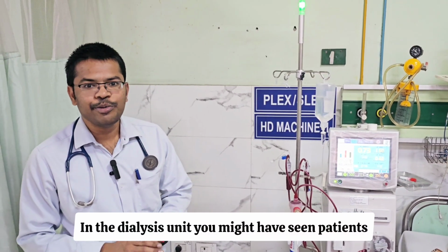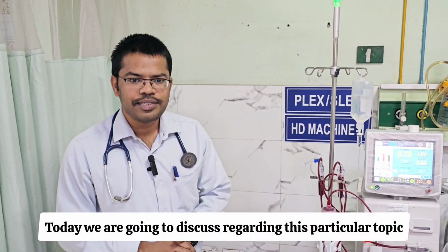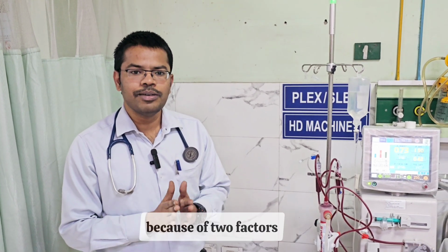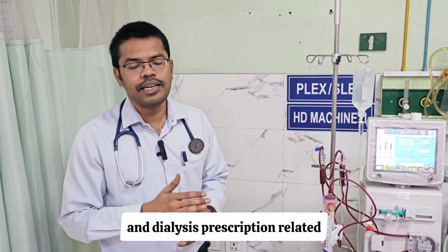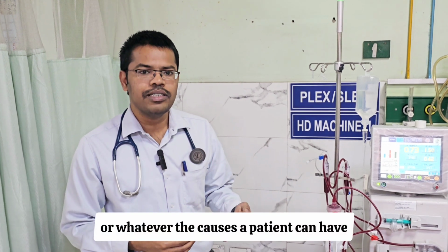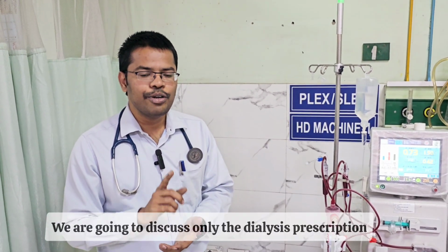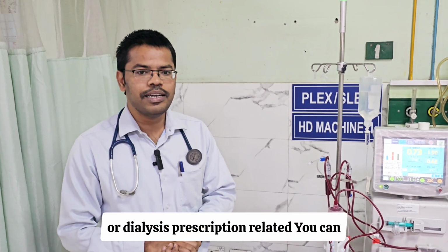In the dialysis unit, you might have seen patients who are having recurrent hypoglycemia, low sugar during dialysis. Today we are going to discuss this particular topic. Hypoglycemia can be because of two factors: patient related and dialysis prescription related. Patient related, because of sepsis or whatever the causes a patient can have, is a separate entity. We are going to discuss only the dialysate prescription or dialysis prescription related.